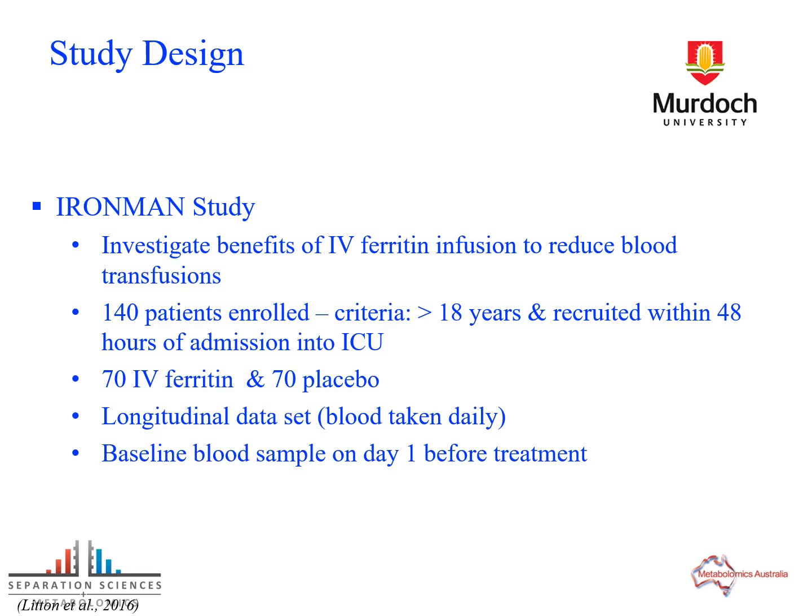And baseline was taken on day one before the treatment, and samples were collected every day that the patient actually remained in ICU. So for some patients, we've got above 6 samples because they've been there for several days. So those samples have been analysed for day one to look at their levels before the treatment occurred. And we've also gained approval to actually do metabolic profiling on these samples as well.